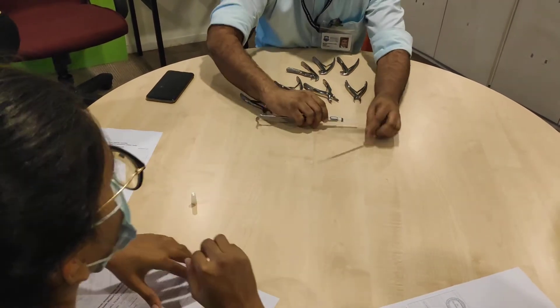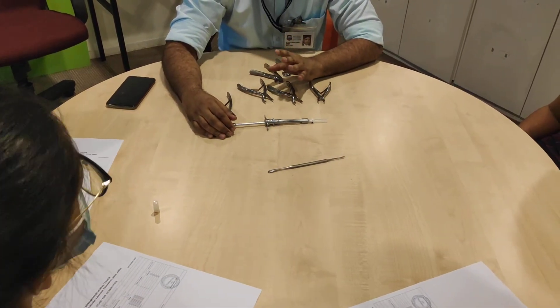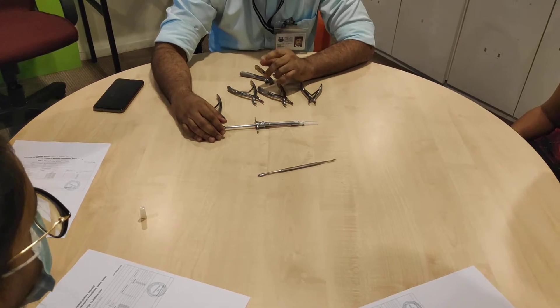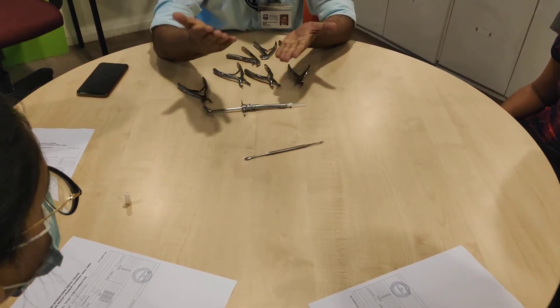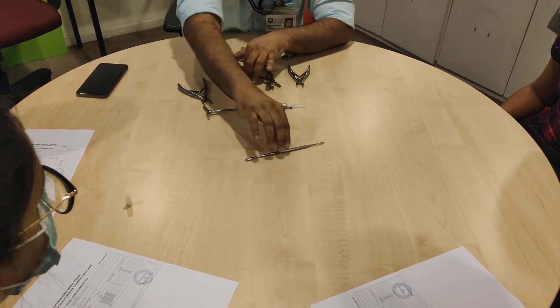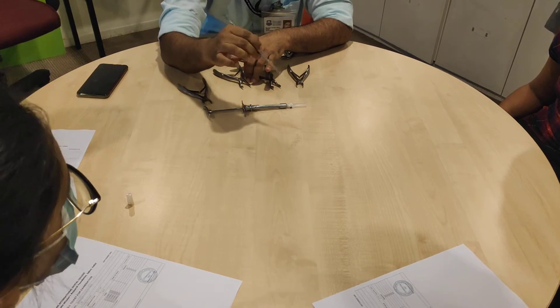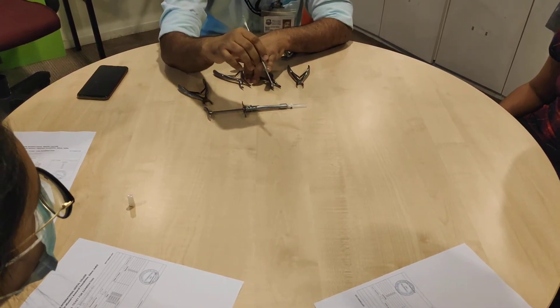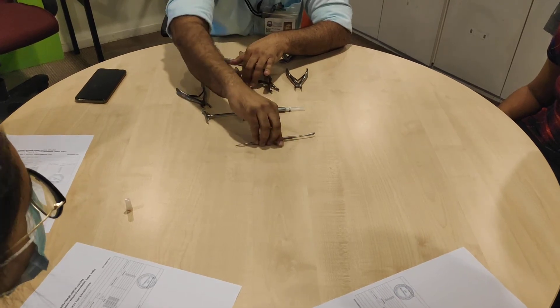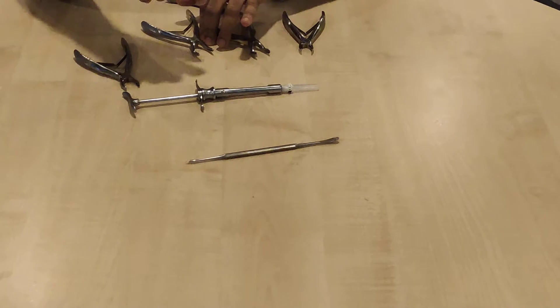Now what is this instrument here? This is a periosteal elevator — not just any elevator, a periosteal elevator. This is actually used for elevating periosteum from the bone when raising a flap. But we are using it for separating the gingival fibres around the tooth so that we free the tooth of the gingival fibres, so the beaks of the forceps can go deeper into the gingival sulcus.